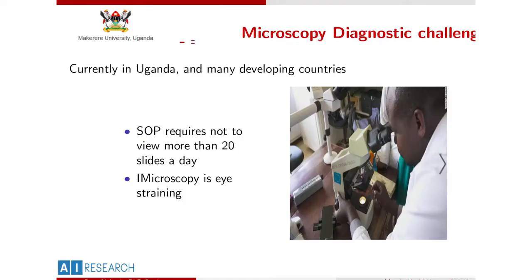Here is a lab technician doing diagnosis, and you see he's looking through the microscope, straining his eye, looking for the pathogens. Malaria pathogens, for people who have done microscopy, and I'll show you an image of it, are very small. So you have to really strain your eye to be able to view them. So it is very eye straining.